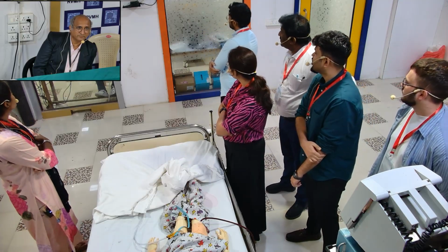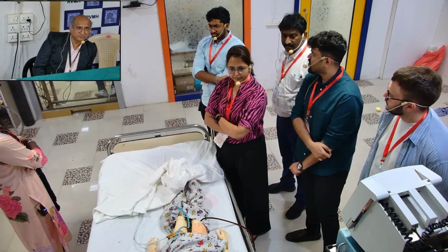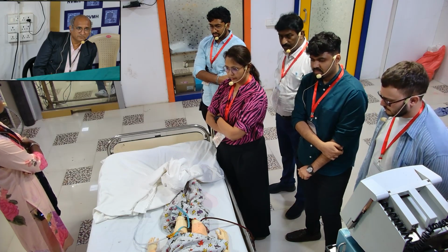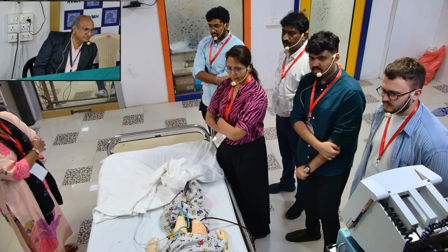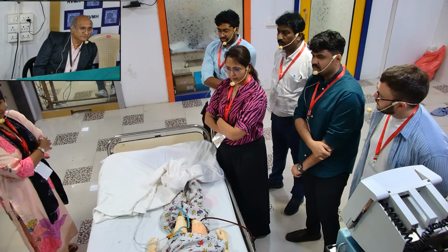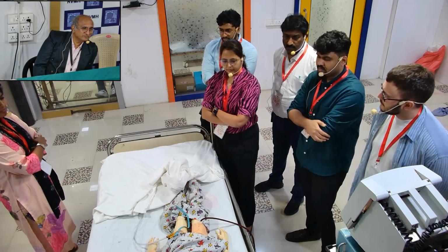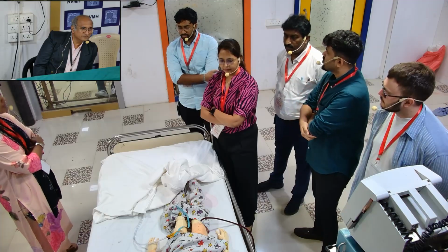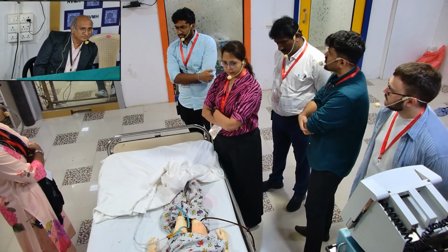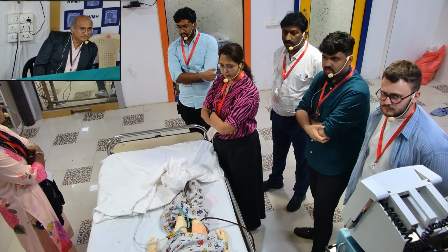So, sir, there was a leak also, and the inspiratory tidal volume was around 180 and expiratory was around 40, and in volume it was going below the baseline level and not going up to 40-50 ml. So in the case of pneumothorax, if there is something which is causing the air to get there, we will get a leak and hypotension with increased pressure. So P1 will also be low. P1 will also be more negative.